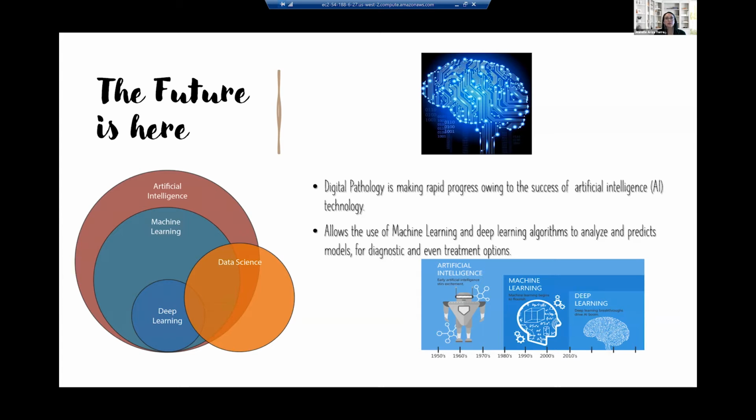It differs from machine learning in how each algorithm learns. Deep learning is also an automation of the extraction process by layers, with networks capable of learning unsupervised from data, and it utilizes a hierarchical level of artificial networks. And this is the one that has been mostly used in our image analysis.